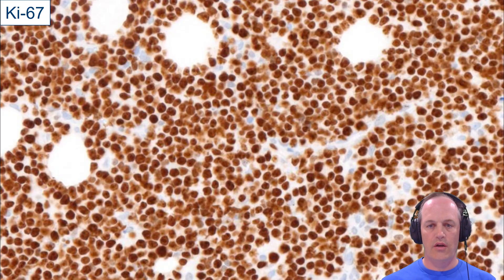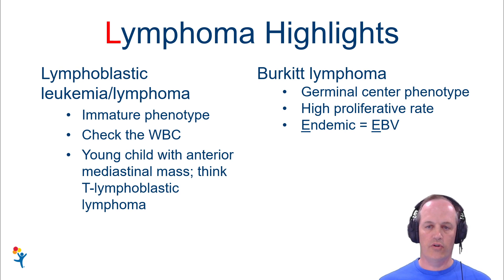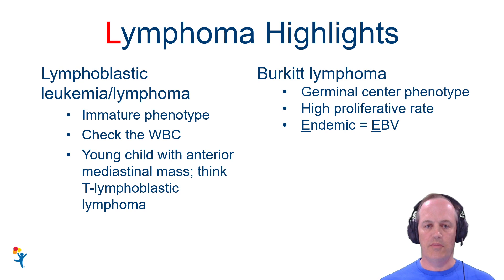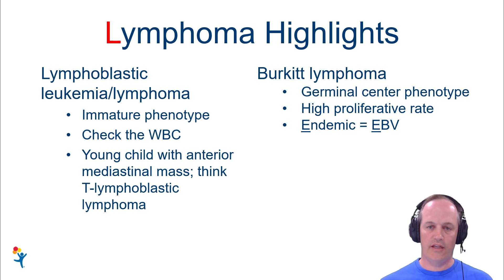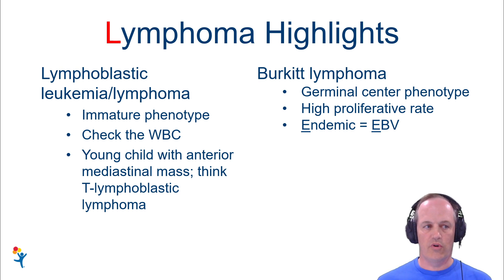Here's the MIB1 / Ki67 - it's staining almost every single nucleus of the tumor. The few nuclei that are negative are endothelial nuclei. For the highlights on lymphoma: lymphoblastic lymphomas are the most common neoplasm in childhood, they have an immature phenotype, and knowing the white count and looking at the peripheral smear is helpful. If you see something in the anterior mediastinum of a child, think T lymphoblastic lymphoma. Burkitt has a germinal center phenotype with a very high proliferative rate, which drives the presence of tingible body macrophages - though even lymphoblastic lymphoma can have them if the proliferative rate is high. Know that the endemic form is more often associated with EBV.